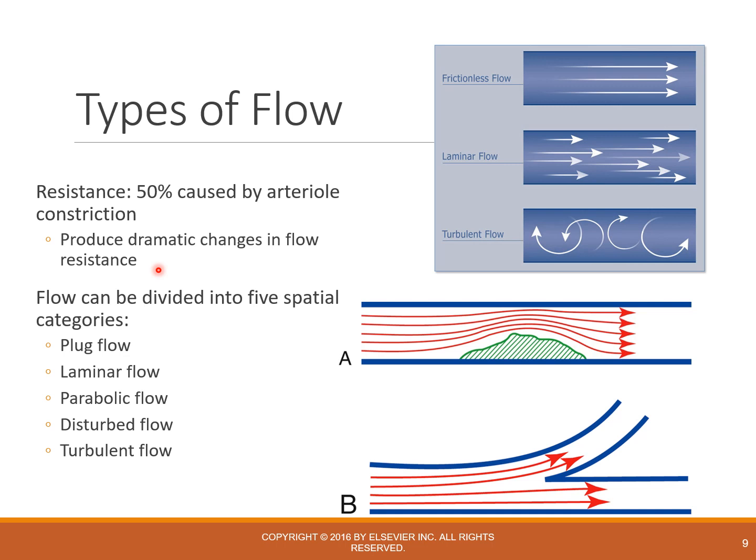However, if I had them get up, run 5 minutes on a treadmill, and then re-evaluated, because the blood flow requirements to those muscles would have been so dramatically increased, those arterioles are going to relax, allowing more blood flow to the muscles. I would see a very significant change in how the blood is moving in that area because of that change in arterial constriction, the increase in the radius, the dilatation of those vessels, and that would change how I see the blood acting in the body.